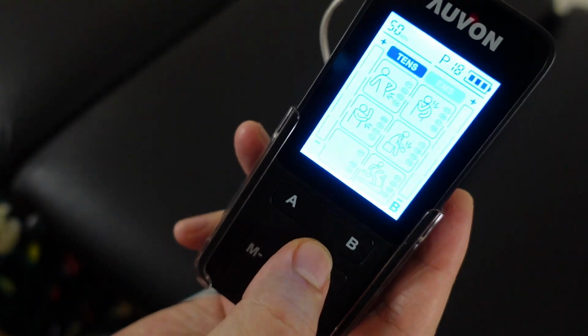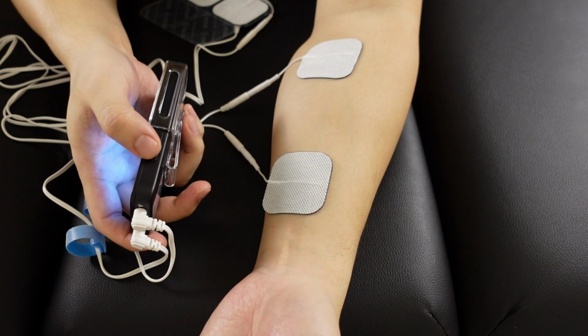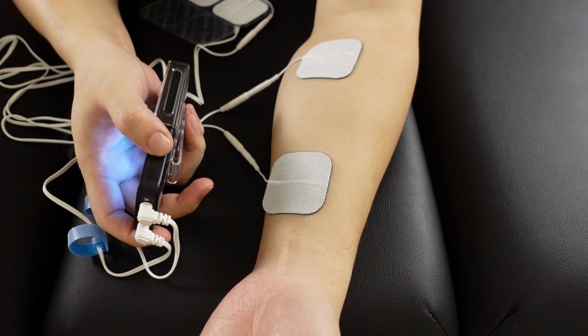Once you've chosen that, you can manually increase the amplitude or decrease it to a tolerance that you can handle. What you want to feel when you increase the amplitude is somewhat of a subtle paresthesia, or some kind of weird tingly feeling. And it should generally be somewhat uncomfortable, but it shouldn't be painful. And of course, if you use something that requires more muscle activation and you want to see some of that muscle pulsing, you can increase it to the point where your muscles start to twitch.